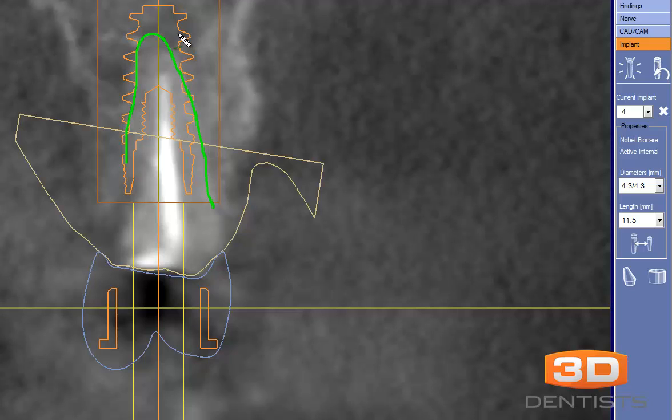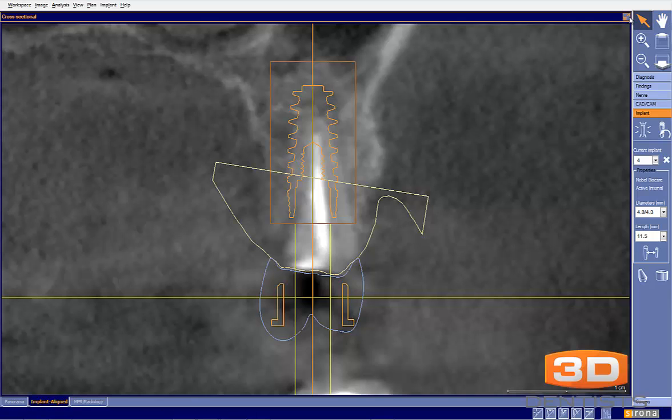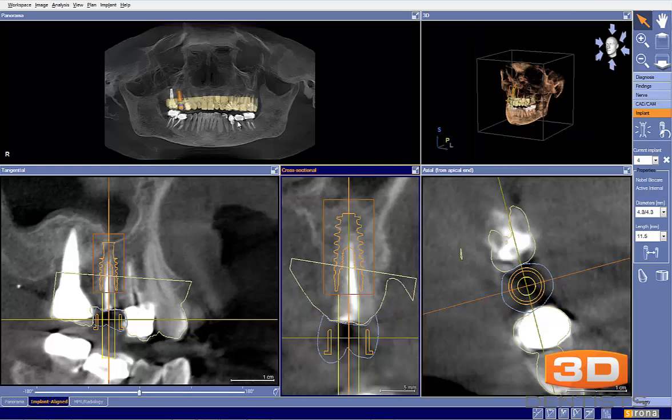In a case like this, my experience has shown that we will get the stability. We just need to make sure that we undersize our osteotomy. Maybe just a 2.0 drill, or a 2.8 drill, and then place the implant and allow the aggressive nature of the implant to engage into everything. Other than that, I think everything looks great. Thank you for submitting.